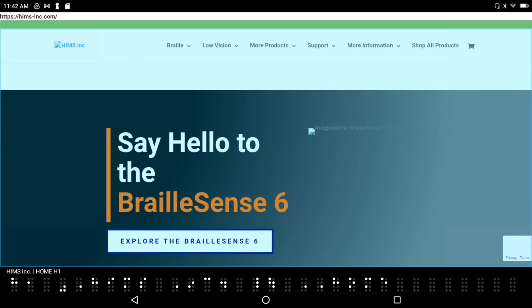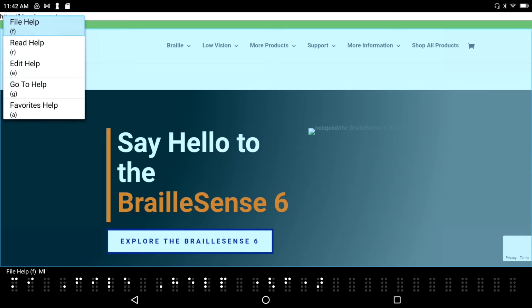But here I am, and let's say that I forgot how to navigate around by headings or bring up a list of items to navigate by. I can press space with H right here. File help, F, menu item. And I've got all of these items. Read help, R, menu item. That I could go in and read about. Edit help, E, menu item. Or get all the hotkeys and shortcut keys for help. Go to help, G, menu item. Go to help with a P at the end. So I'm going to press enter on that.